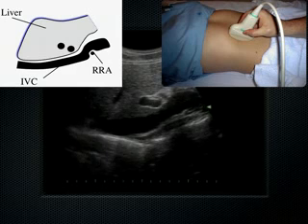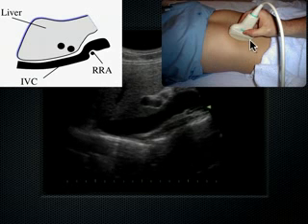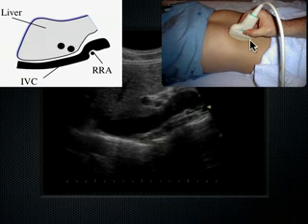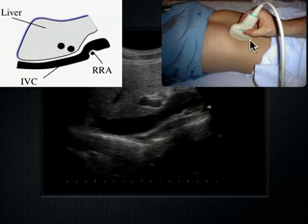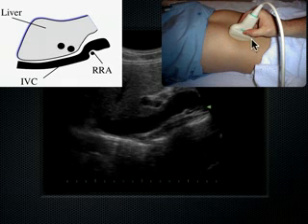All right. So if you look at where the probe is, I want you guys to look here. This probe is in a parasagittal right axis. What does that mean? Para means next to. Sagittal means anterior longitudinal, an anterior approach to the longitudinal plane.